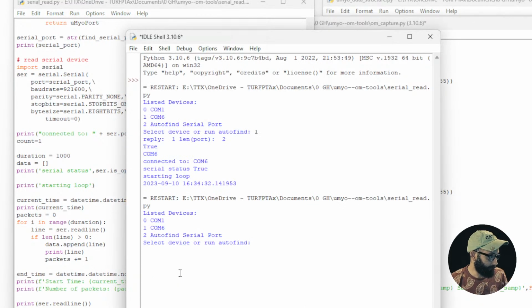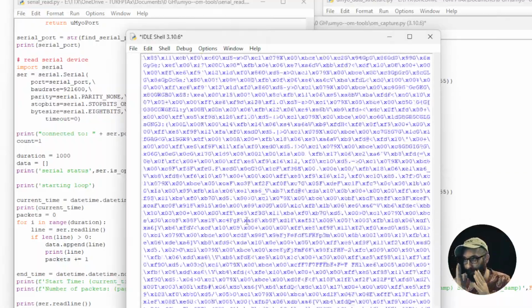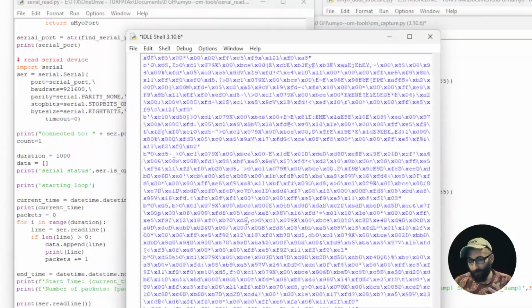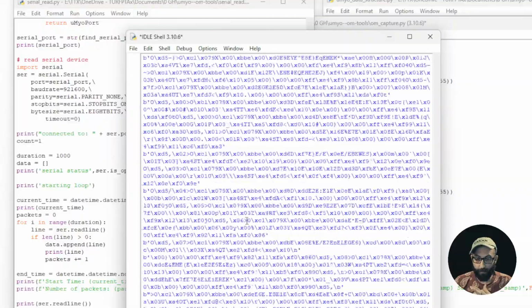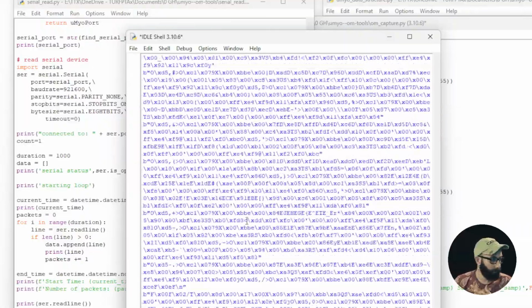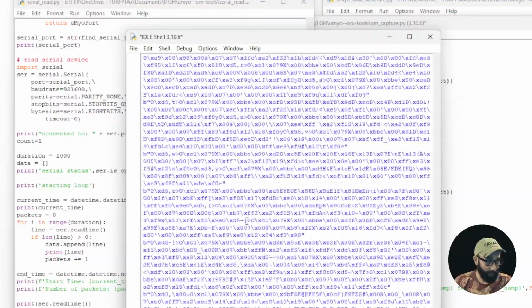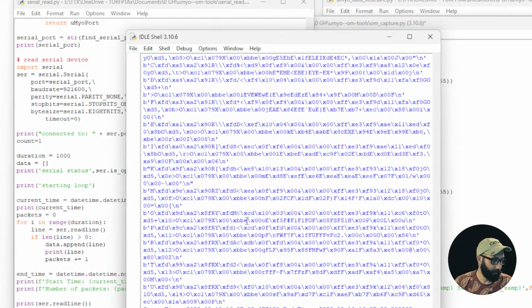Alright, so now we'll F5 it, run it. It's going to run 1,000 times, and we'll see exactly how many packets are sent. I'm also printing this to the screen, so this probably is going to create a lag. So it's going to make these go slower than normal sometimes. I'm not sure how that works, and maybe 1,000 is too many. So the number of packets is 1,000. Good. Start time is 1637.